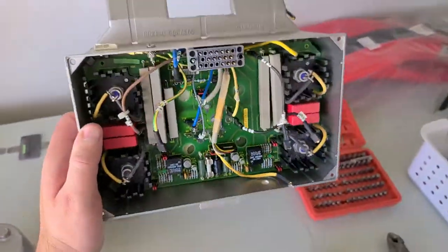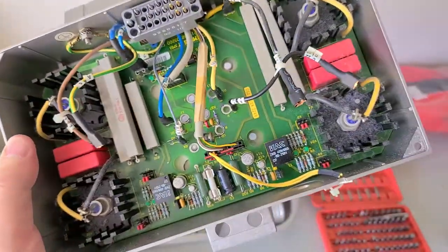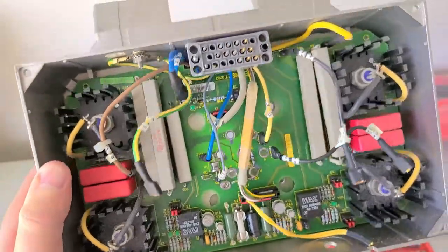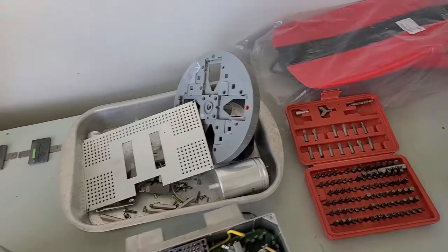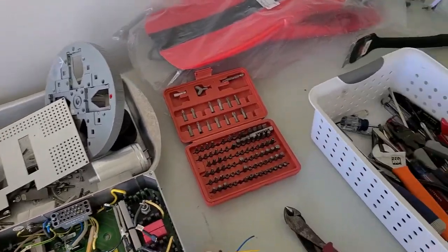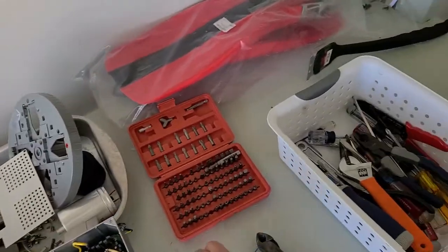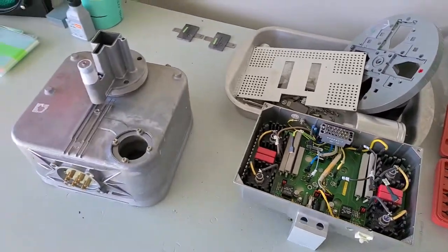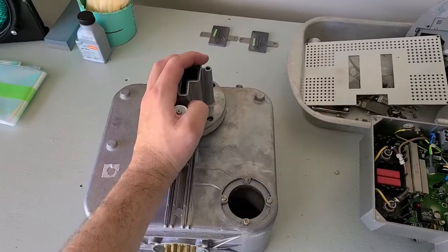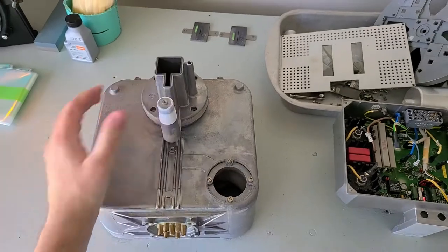And here, you know, just the control panel. You can see it has a lot of parts in it. Some fuses, resistors, whatnot. Yeah, pretty interesting. I'm just going to go ahead and throw all of this away. Keep some of this copper wiring here and whatnot for other projects I do. Alright, next up is taking this apart. Getting the oil out and getting the tube out of it.